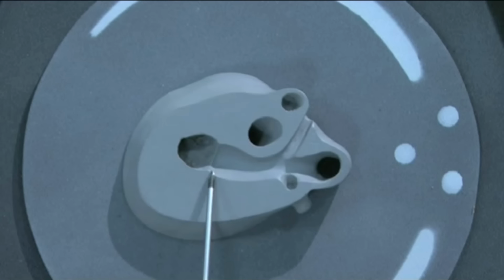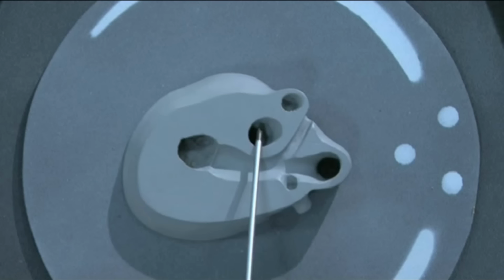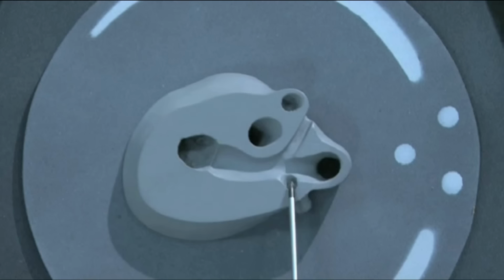Coming down the pulmonary outflow, when it's more or less alongside the ascending aorta, the right branch comes off. But in this view, it'll be heading up towards us and won't be well shown. The left branch tends to disappear down into the lung and head slightly more inferiorly, and so it's slightly more difficult to see. As soon as the branches come off, this is the ductus arteriosus heading down towards the descending aorta.